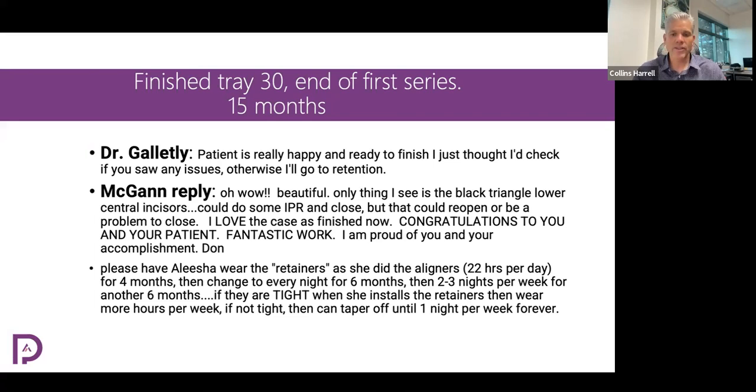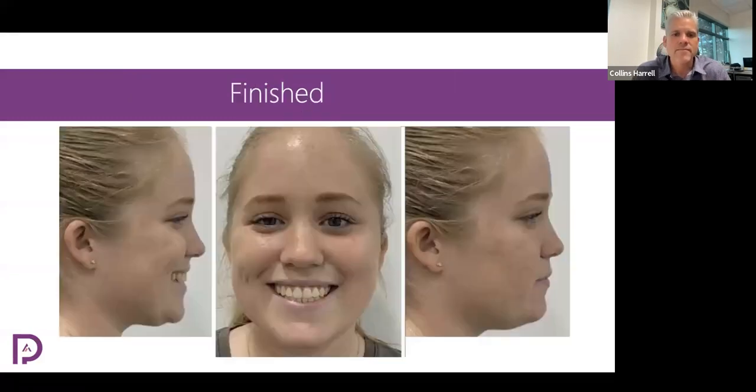And so, although I think you can be successful with 2 to 3 nights per week, depending on how they feel when you put them in, my experience is that tends to allow the patients to just get out of the habit of wearing their aligners or their retainers at night. And if they just always have them in every single night, it just becomes a lifelong habit for them. So see what works for you and your patients. There's different ways to approach that.